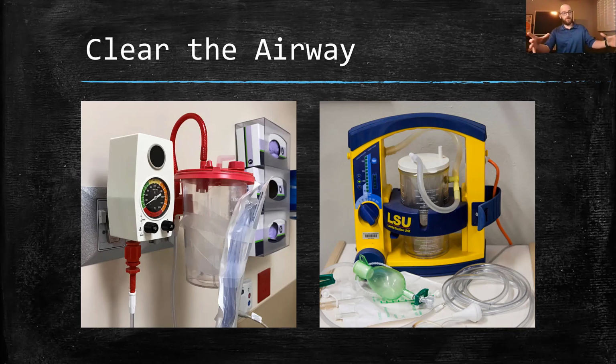Because you don't want to have that patient on the ground, supine in front of you, and they vomit in their airway, and you look at them and say, okay, 1 second, let me go get my stuff. And then you come back, all right, now we'll suction that out. You want to do something right away, because we have to fix that problem right away. Blood, vomit, something like that in the airway is a life threat. So we need to deal with it right away. And we're not sitting there ready to go, waiting for somebody to vomit, having our suction ready.